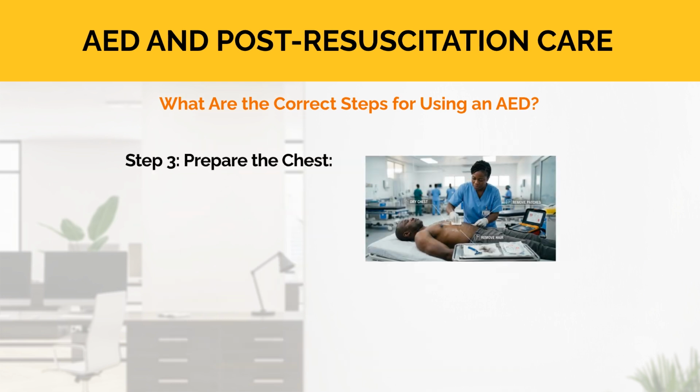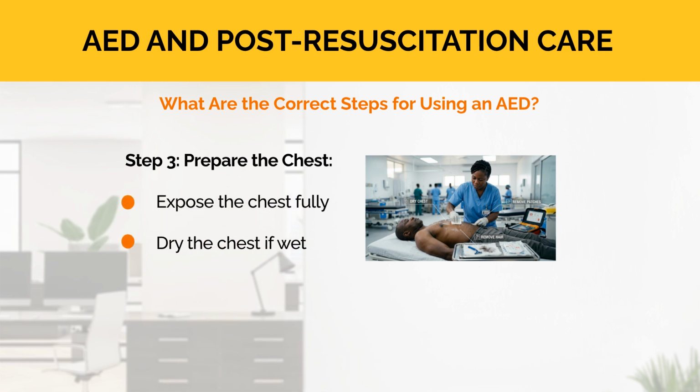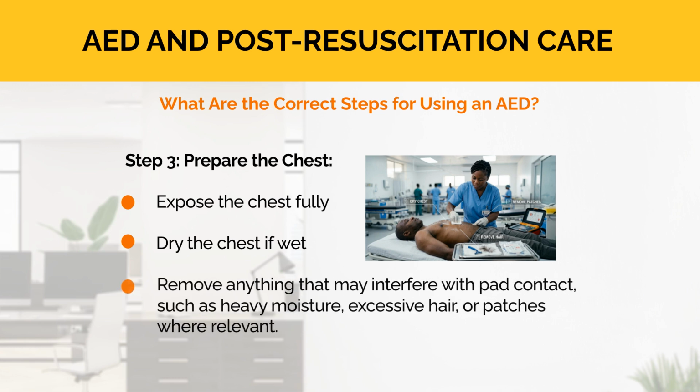Step 3. Prepare the chest. You start by exposing the chest fully. Dry the chest if wet. Remove anything that may interfere with pad contact, such as heavy moisture, excessive hair, or patches where relevant.